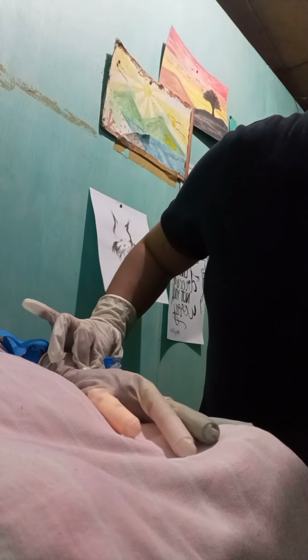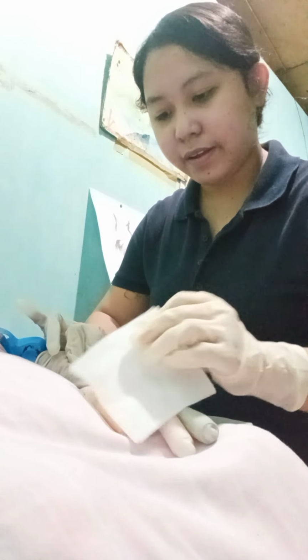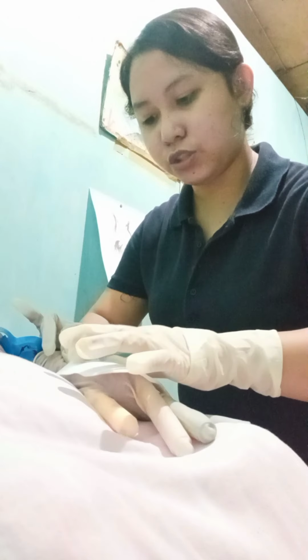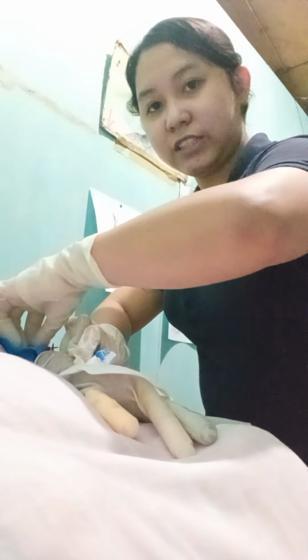Okay. Then, put a sterile pad under the hub while applying pressure to the catheter. Remove the tourniquet.